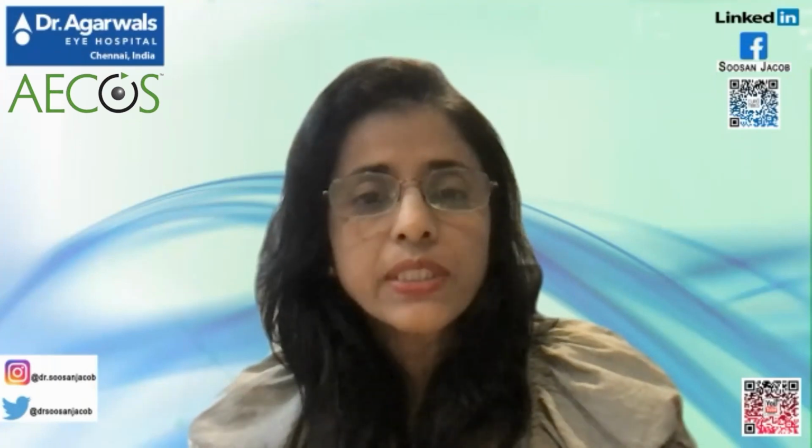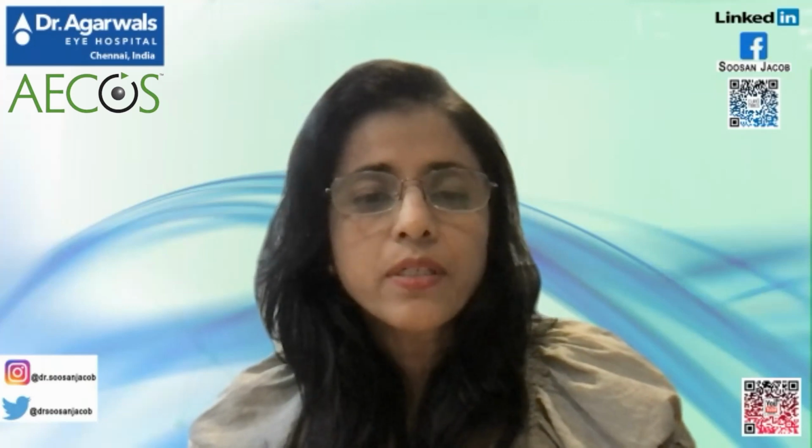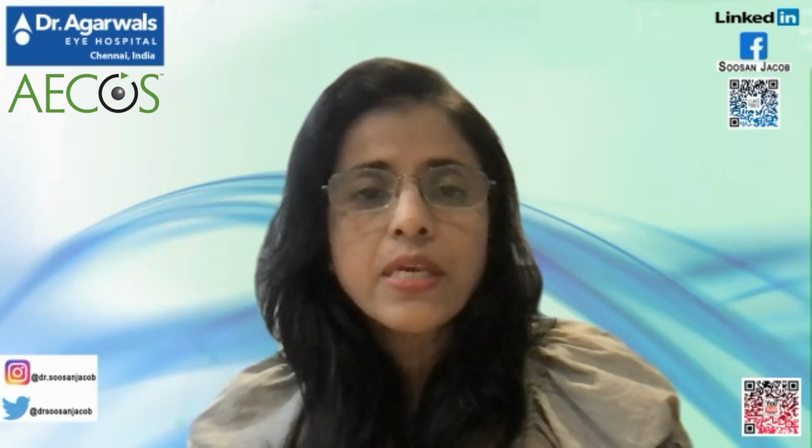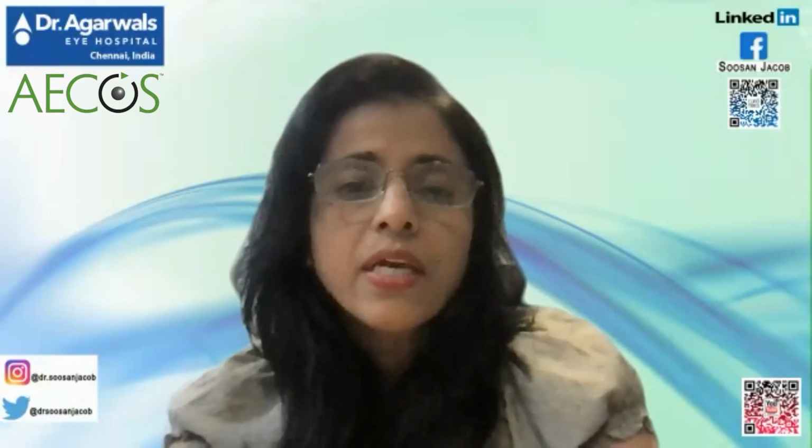Yeah, I think that definitely is something that you can work on further. Some people are already doing this because there are a lot of surgeons who have been using topo-guided PRK for keratoconus for many years. The limitation they used to face was that the amount of tissue they could remove was limited, obviously, and it's still going to be limited even with CARES. But because of that, the effect they could get was minimal.